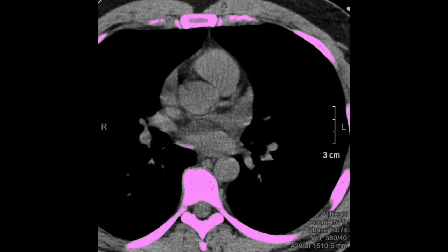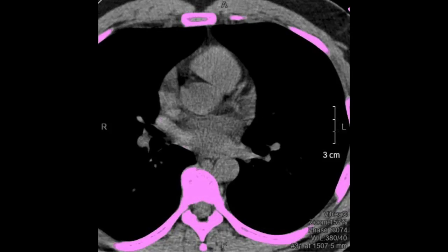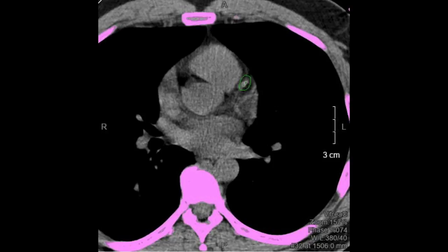Okay, now you're going to start to see that left anterior descending. This right here is the Widowmaker. This is the one where you want the least amount of calcification, because that's basically what can cause sudden death right here. So my score is actually a 4 in this area, which is fairly mild. Obviously the goal is to have 0 or nothing down there, but that's the Widowmaker right there.